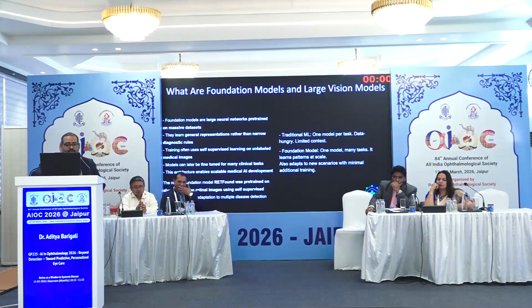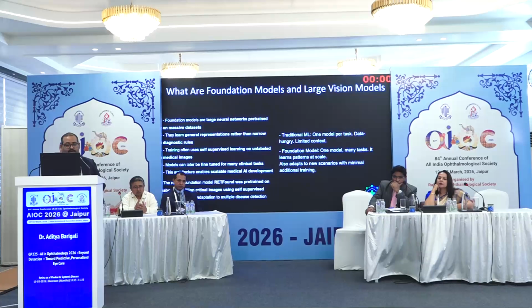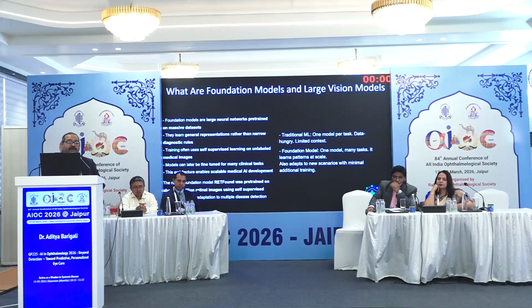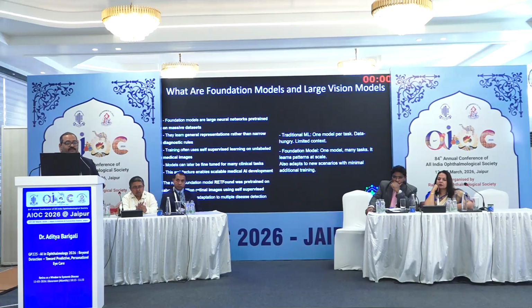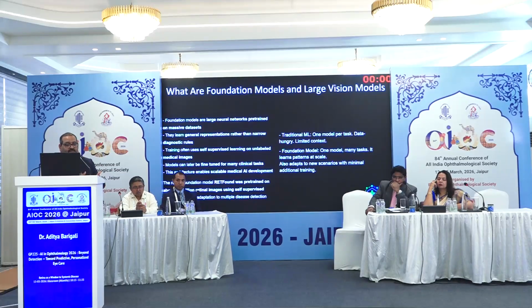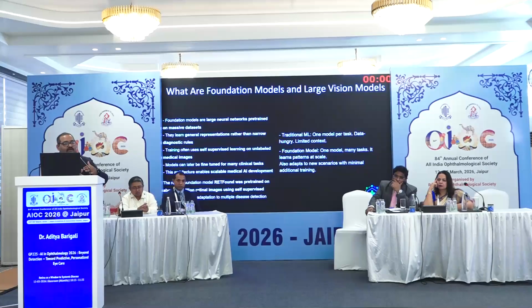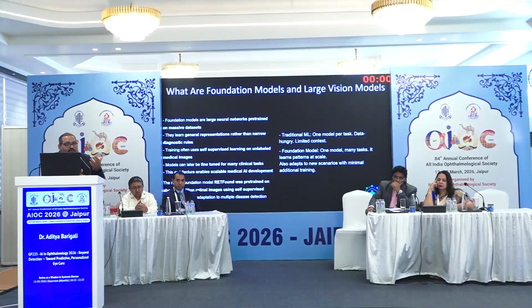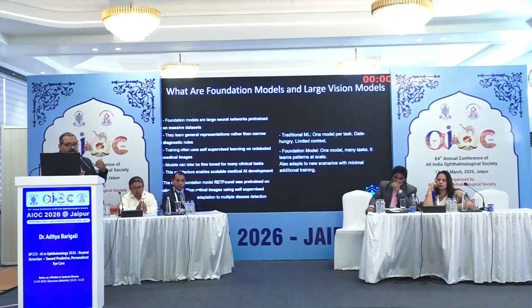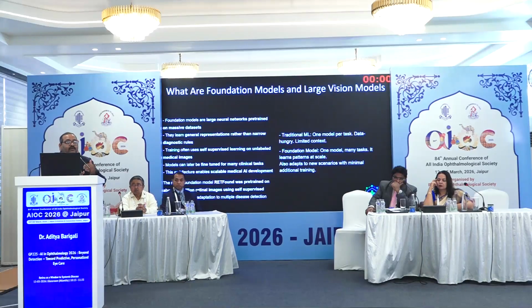So I will just go through this. Traditional ML is, as I told you, one model per task, data hungry and with very limited context. It means nothing to the patient. Foundational models are one model which does many tasks. It learns these patterns at scale and is able to amalgamate and compile a diagnosis much like the way we think. I think even the multimodal model which was discussed previously is part of a foundational model.